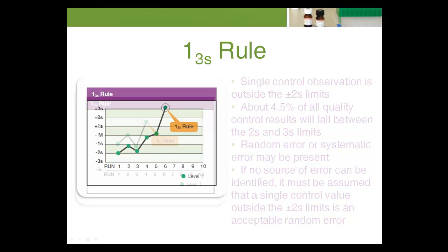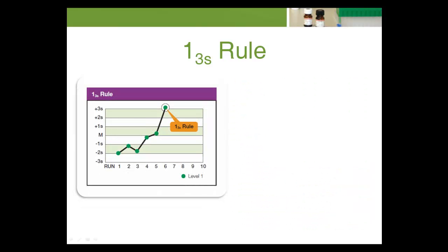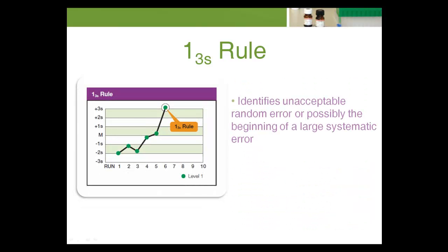The 1-3s rule identifies unacceptable random error or possibly the beginning of a large systematic error. Any QC result outside positive-negative 3s violates this rule.